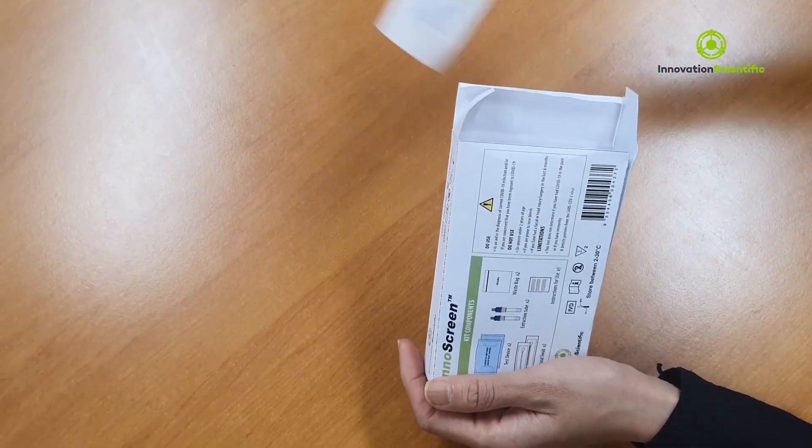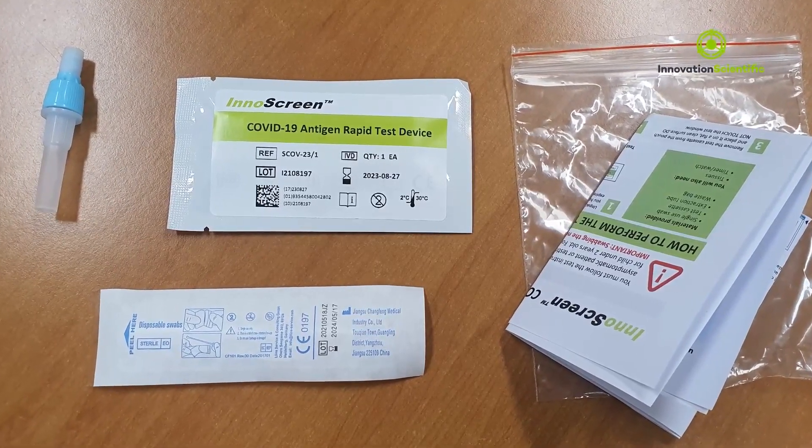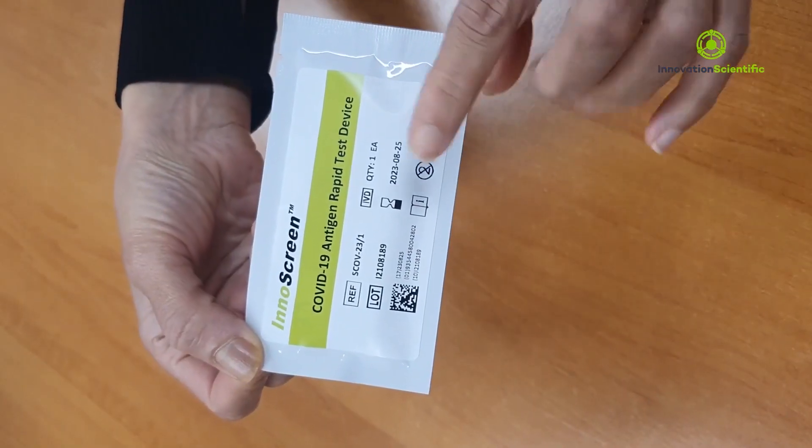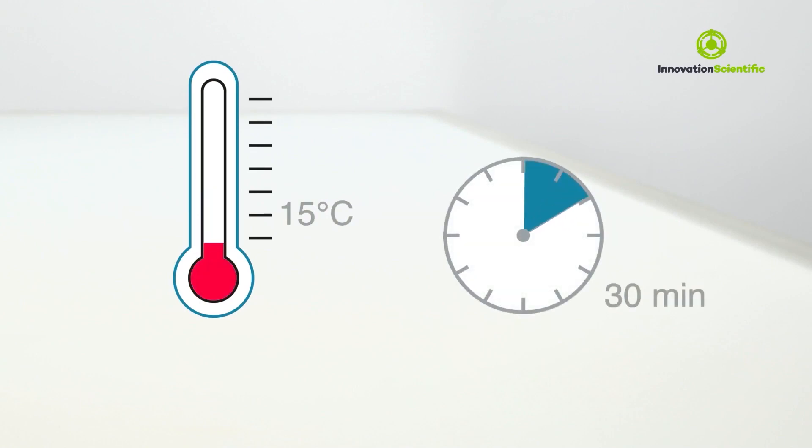Unpack the test components. Do not discard the box. Ensure you have all the components required as specified on the packaging. Do not use if they are expired or damaged. Ensure that the test device is at room temperature before starting.